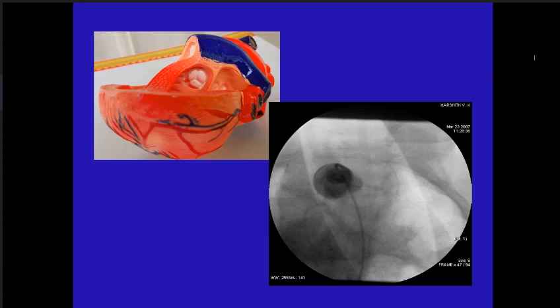So right will hook the left and left will hook the right. Is it so, sir? Yes, true. Now this is only for a straightforward CTGA. If you have dextrocardia and all that, then it becomes more complicated. I'm not talking about it. In a straightforward CTGA, if you hook it like a left, you probably will get a morphological RCA. And if you hook it like the right, you may get LCA, but you may have to hunt for it because RCA is not coming from the anterior sinus. Normal RCA comes from the anterior sinus, no? Here it's coming from the posterior sinus. So sometimes, like an anomalous RCA, you have to hunt for it, with a little bit of change of catheters, maybe a Tiger catheter, or an Amplatz catheter, or even a multipurpose catheter. Not difficult, it's easy.